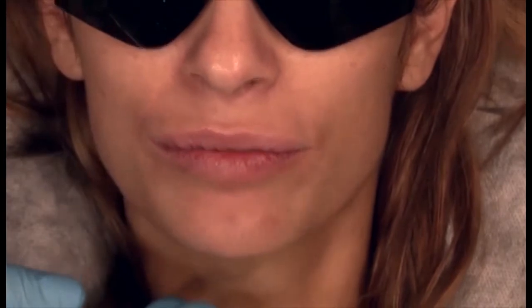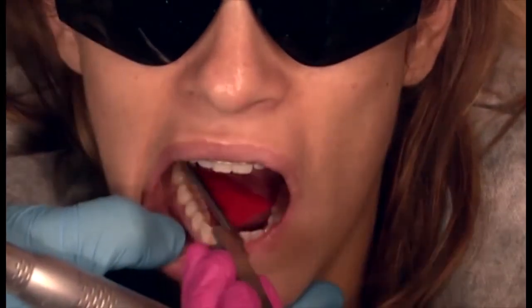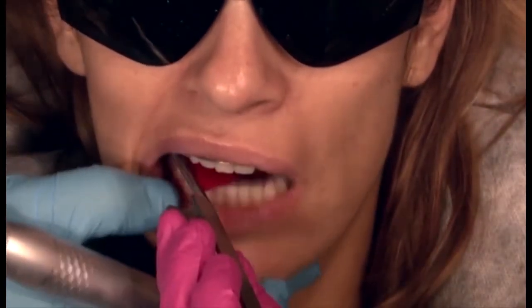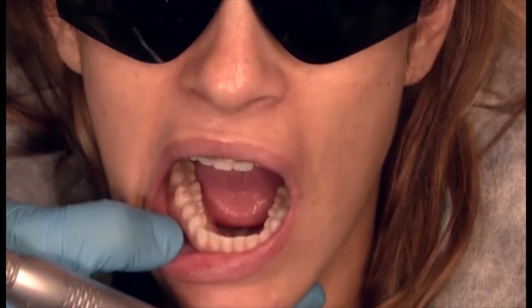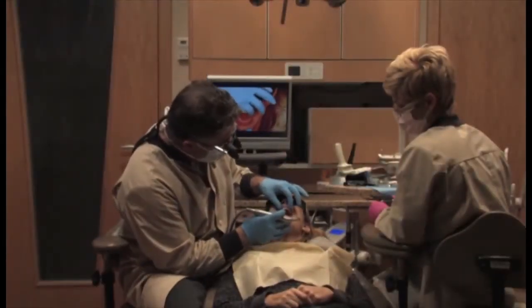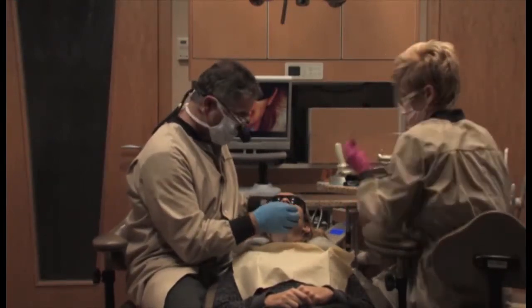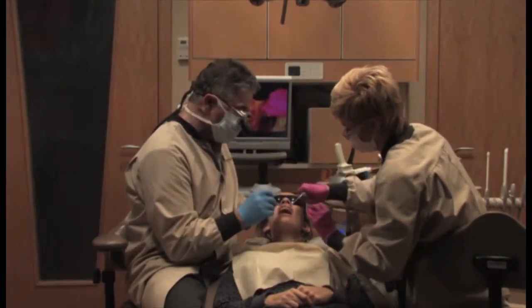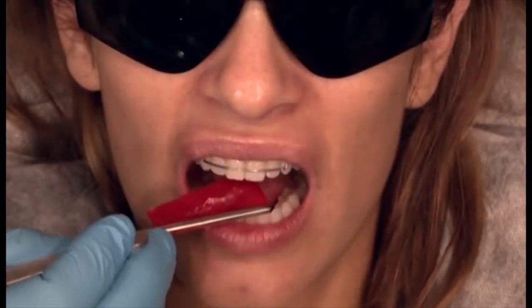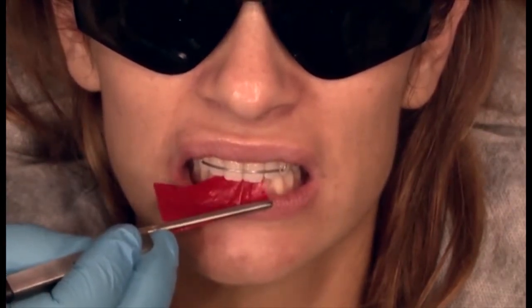Let's try it again. We'll mark it with red. Tap up and down. Now where do you feel the contact? On both sides. Starting to feel it on both sides. Let's go across the front. I'd like to see where the deprogrammer is. I'm going to double check, see if it's holding very much here. Close. Stay closed. Still holding here. Open.